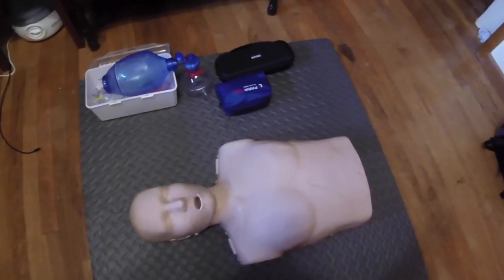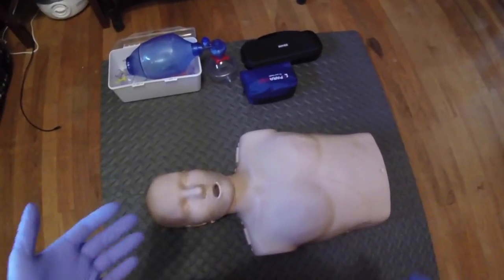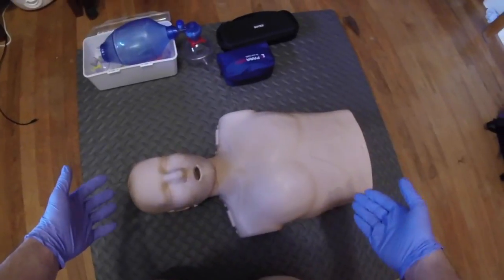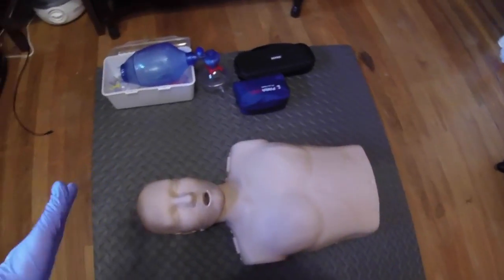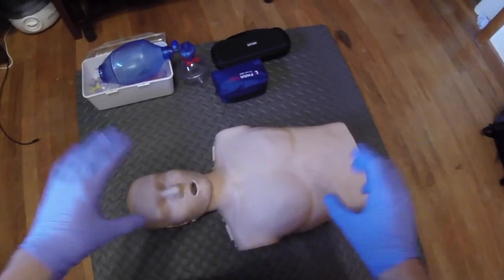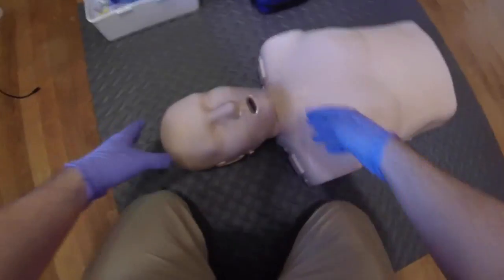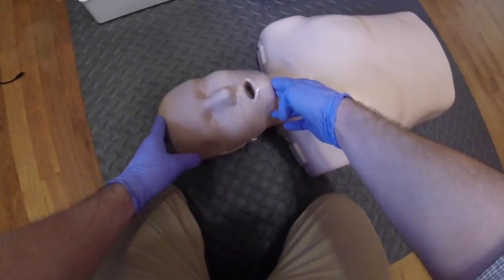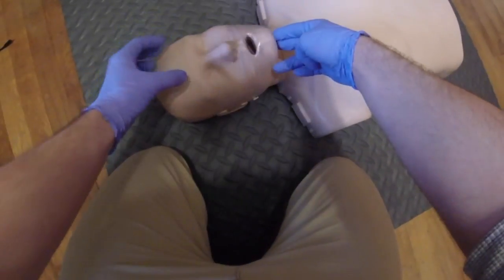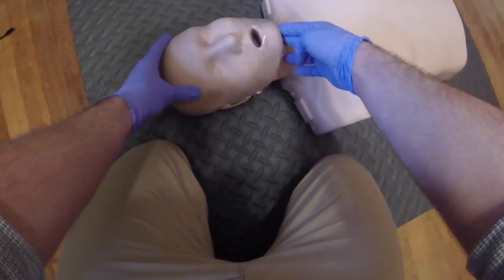It might come as a shock, but I actually bought quite a lot of tools to practice at home with. First off, we have Preston the mannequin. I spent $134 on this mannequin, and it's really neat for a lot of reasons. One of the cool things is you can do the head tilt chin lift with this patient to open up that airway so that you can either do mouth-to-mask ventilations with a pocket mask, or you can use a BVM.